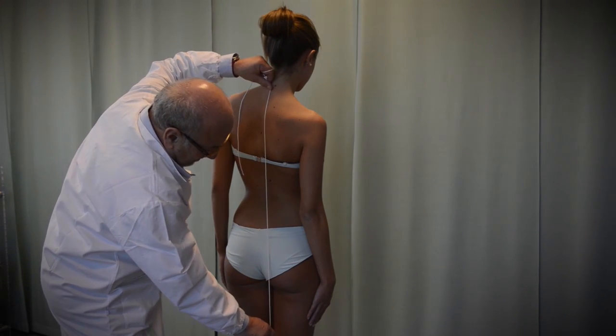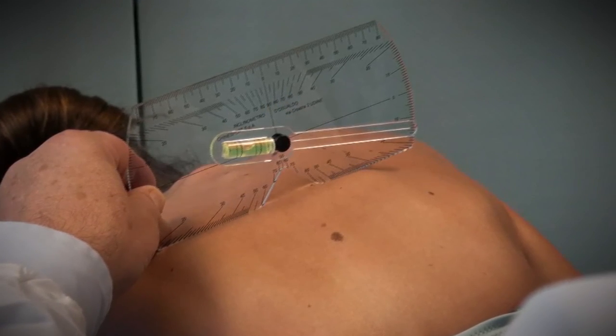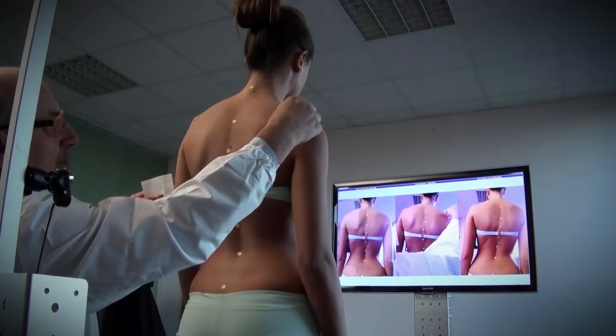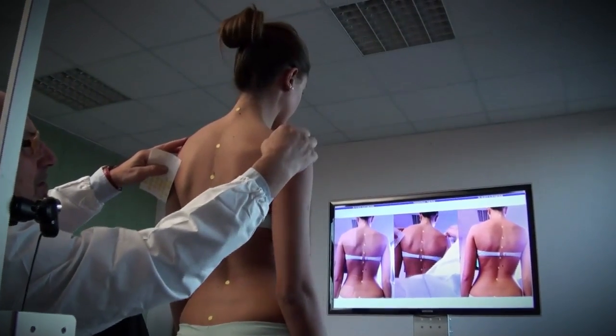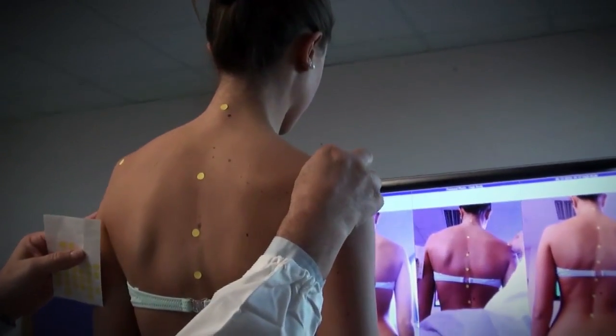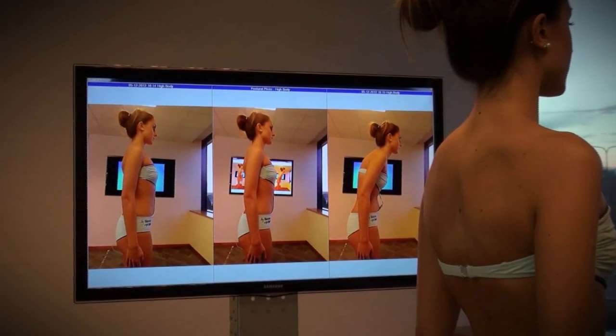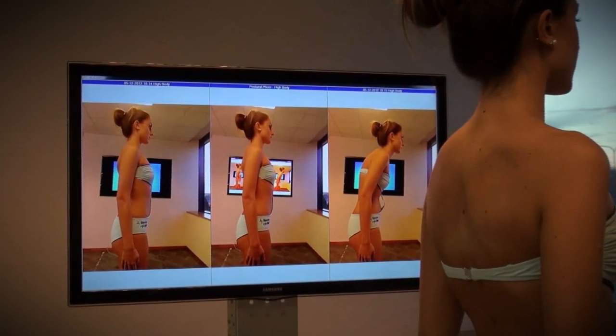Now we analyze the back with a plumb line for scoliosis and with an inclinometer for the hump. We position markers on the points to be used as a reference and use the webcam to photograph the current posture, which we compare with that of a few months ago, and we can therefore evaluate the improvement in the patient's posture.